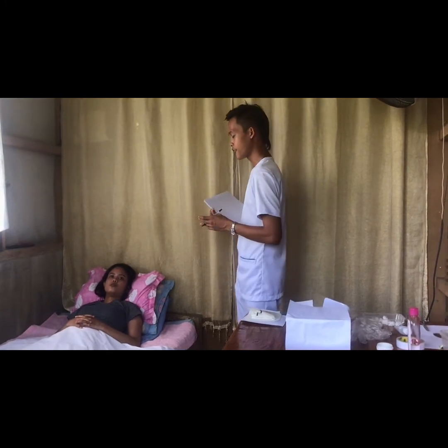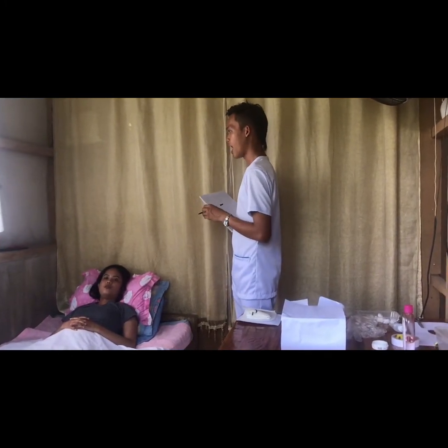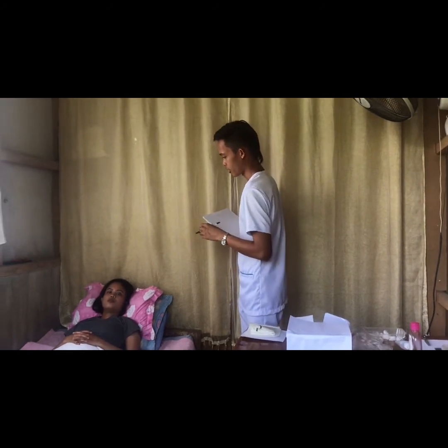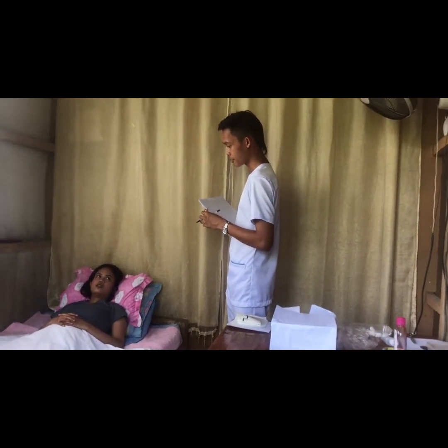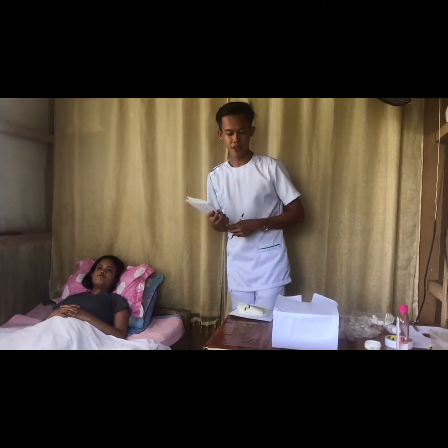So for this time, sir, I'm going to perform your catheterization because there is a medical order in order to control urinary incontinence. Okay. So I want your cooperation. Do you have any questions about the catheterization? No. Okay, thank you. So for this time, we're able to assess the patient.